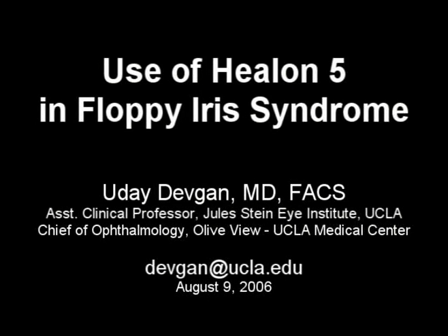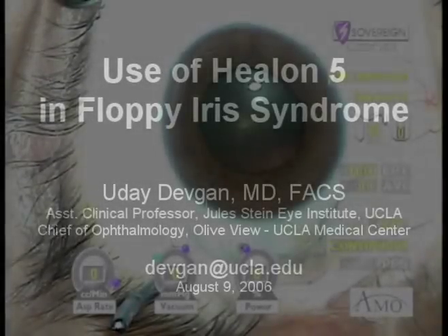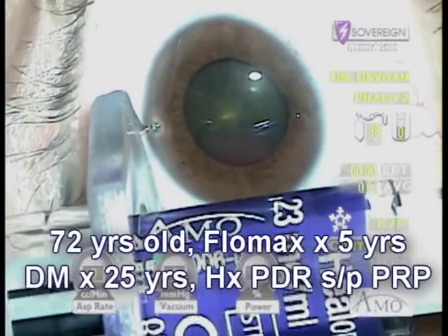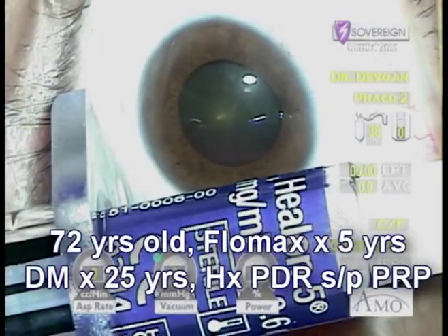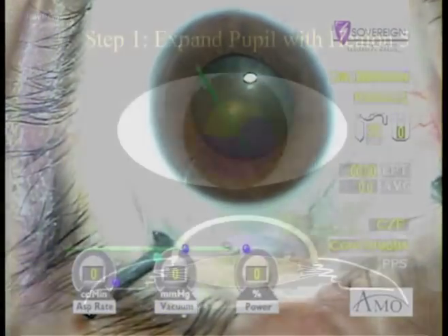Use of Helon 5 in Floppy Iris Syndrome. Helon 5 is a visco-adaptive device which is very different from traditional viscoelastics. Understanding this difference is crucial to using it in our traditional surgeries or in more challenging cases such as this with Floppy Iris Syndrome.